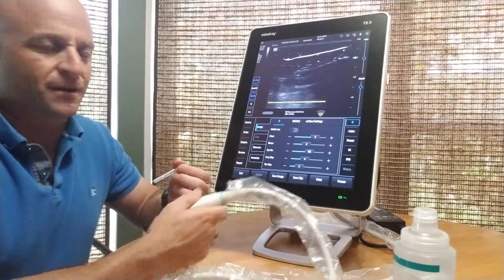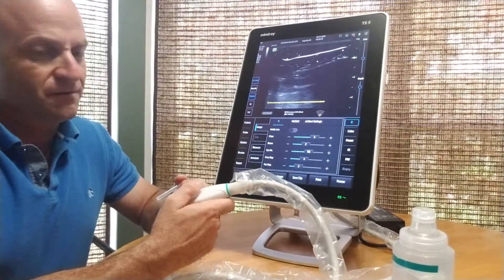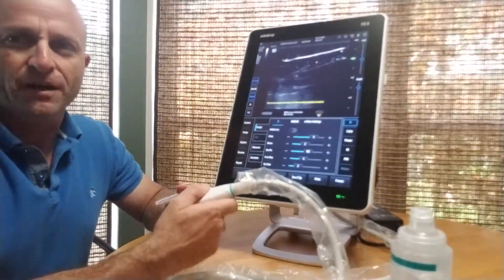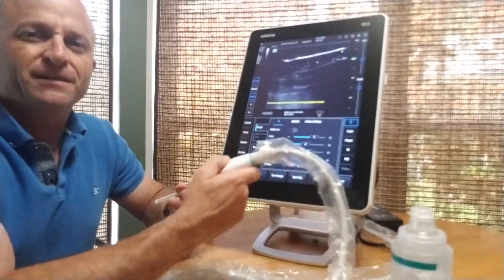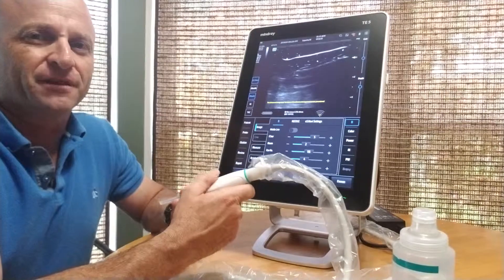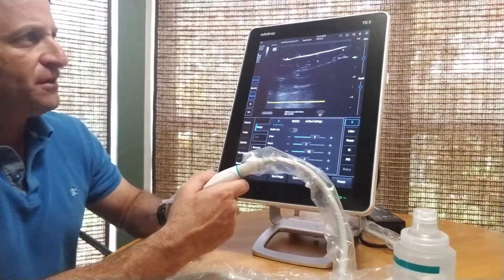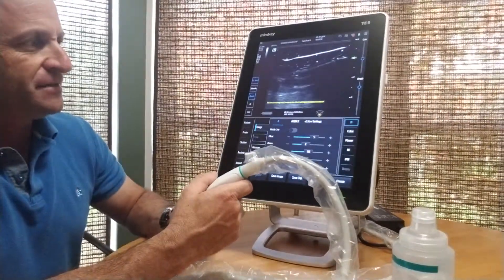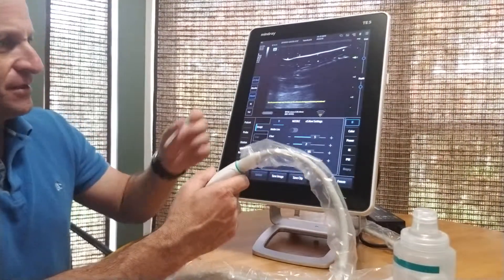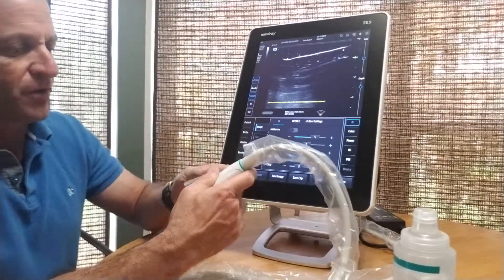Here we are with the imaging again with the TE5 with the e-spatial navi feature. Very easy to use — we select it and we calibrate it.